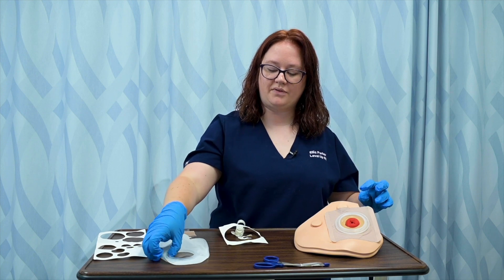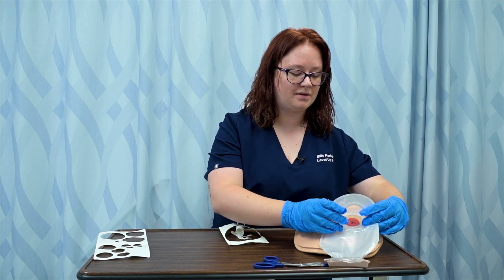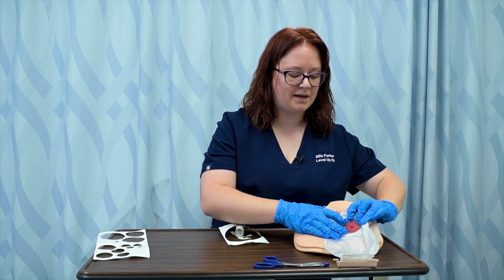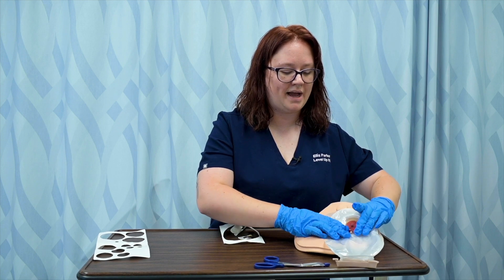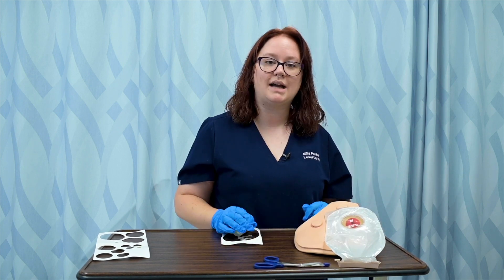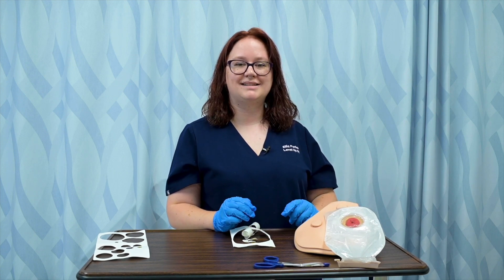And then because I've got the two-piece system, I just need to snap my top piece into my bottom piece, or my bag onto my wafer, so that the bag is securely attached to catch the effluent from the stoma. And that's how I changed my ostomy appliance.